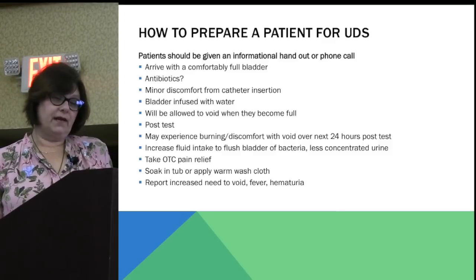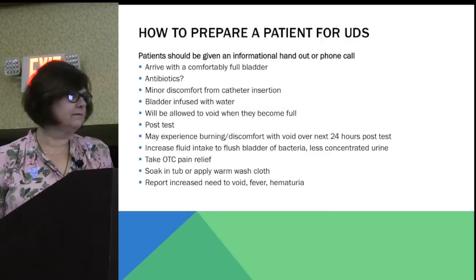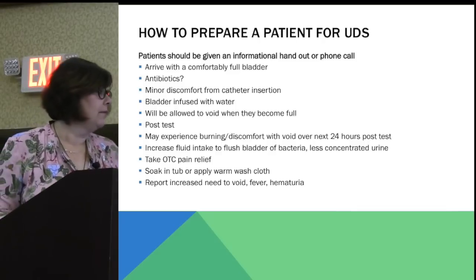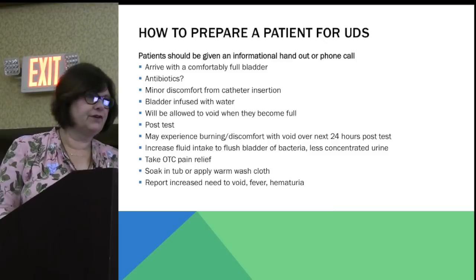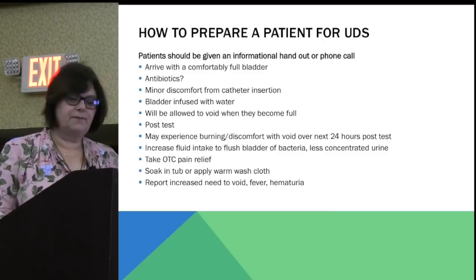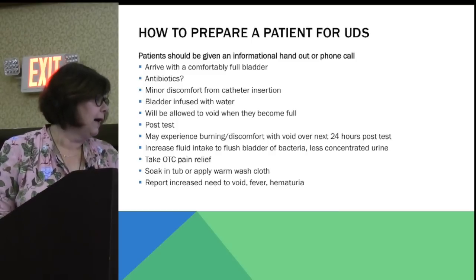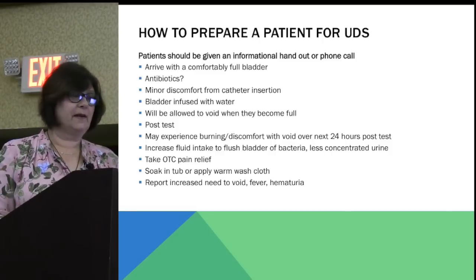Some people like to pre-treat with antibiotics. Some like to give antibiotics after the test. There's various opinions on that, but it is something that people do. Let them know there's some minor discomfort with catheter insertion. Obviously, you're going to do your best to make that as comfortable as possible. That's what I tell them. I say we use lots of lubrication. Most people don't react horribly to this. And then let them know your bladder is going to be infused with water during this test. It's basically the same as your body would do if it's being filled with urine.